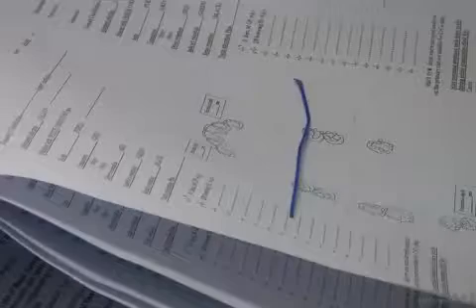If I'm talking about this fulcrum line, these are not principal fulcrum lines. The principal fulcrum line is this one, the last one. But these are fulcrum lines, lines running through the rests. These 2 posterior are preventing them. This is the principal fulcrum line. These anterior rests are preventing the rotation there. Okay? This is called quadrilateral support. 4 rests are present, 2 on each side. These, I don't need to add components for indirect retention.